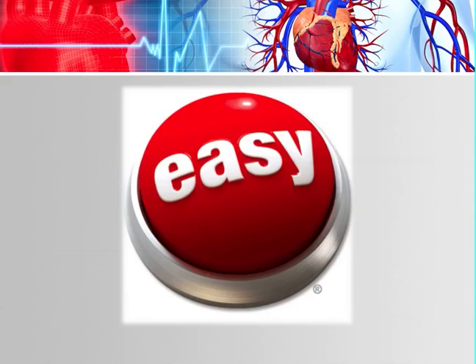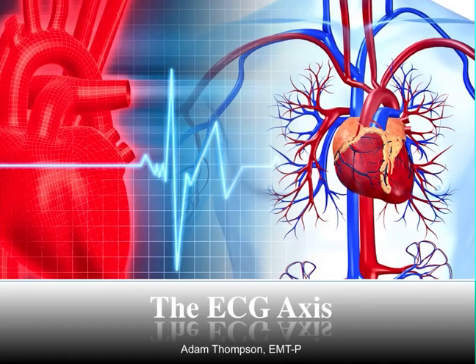Okay, so that was pretty easy, but it does get easier, because I don't expect you to carry this hexaxial diagram with you out on the road. There is another way to do it, and in the next part of this discussion, you're going to see how much easier it can be. I promise you, it's easier than that 5 steps, and that 5 steps is actually pretty simple.